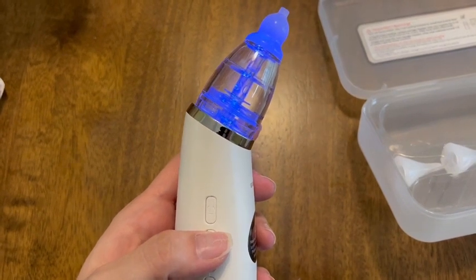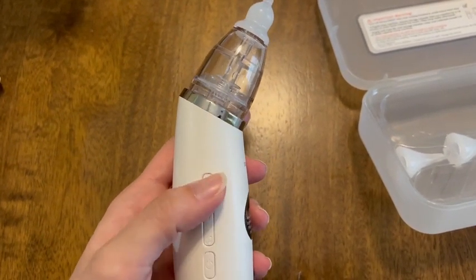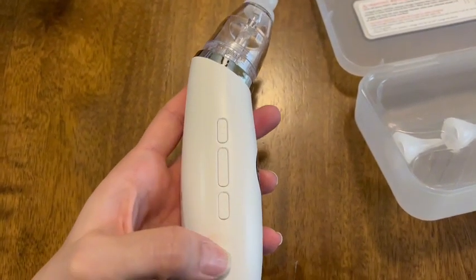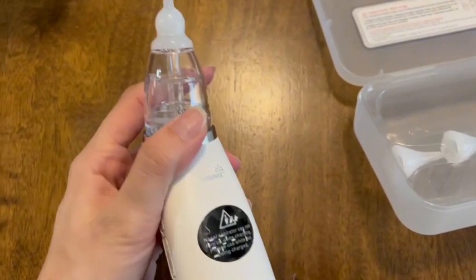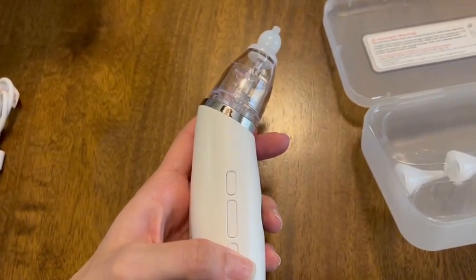That's just a really cool way to keep baby entertained while you're trying to use this, because not a lot of babies like having their nose snot sucked, so this just makes it a little more fun for them. As you can hear, the noise is pretty low, so you don't have to worry about that alarming your baby. Overall, I highly suggest this nose sucker.